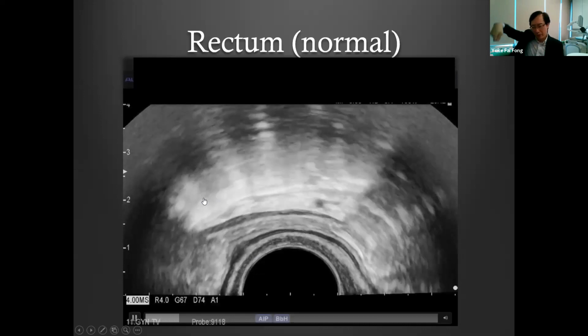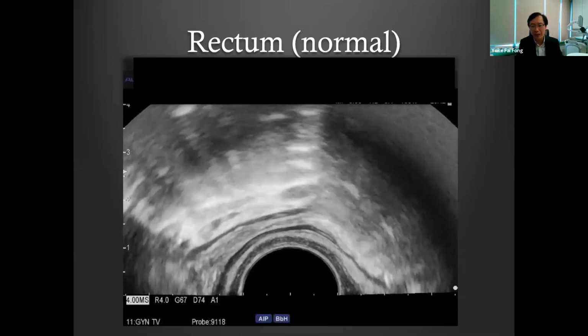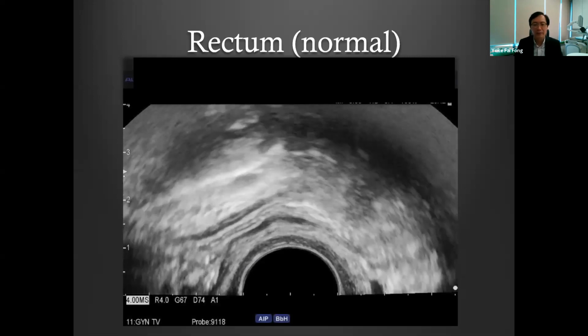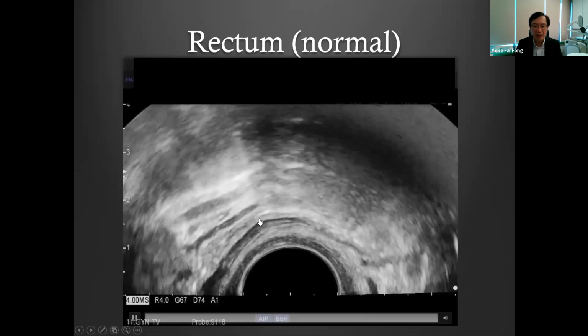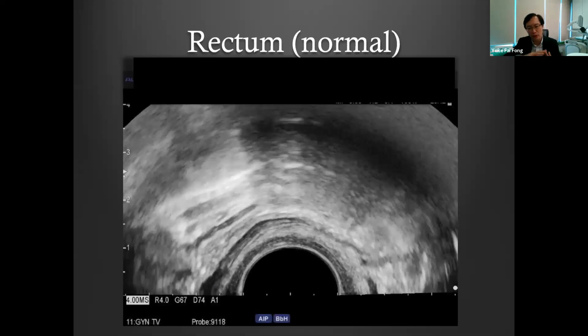Okay, so when I'm down this way, the rectum actually is horizontal. Then I'm moving upwards, the rectum becomes a little bit more inclined. Yeah, so this is the rectum over here. It's very nice and smooth. And you need to especially pay attention to the black layer here. The black layer here is the muscularis propria. You can see it is very nice and smooth. It is indentable. You can actually trace it.